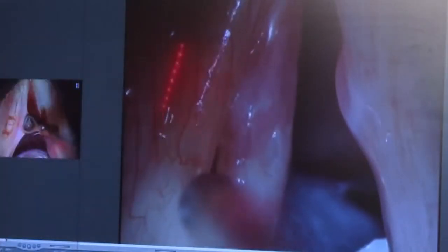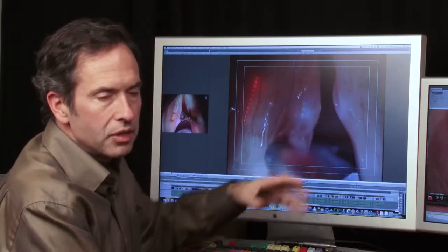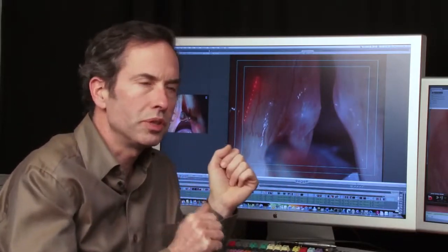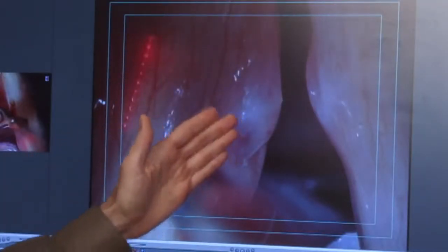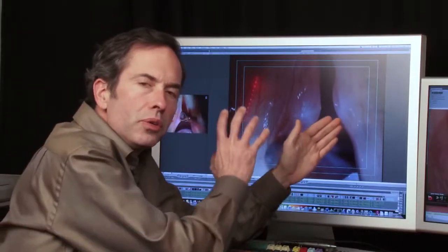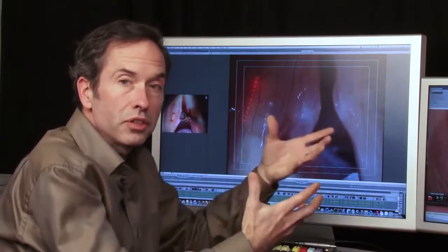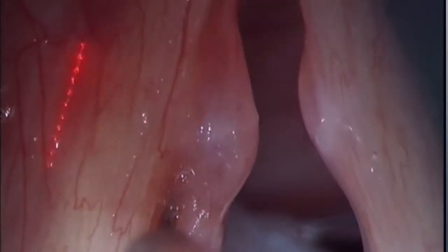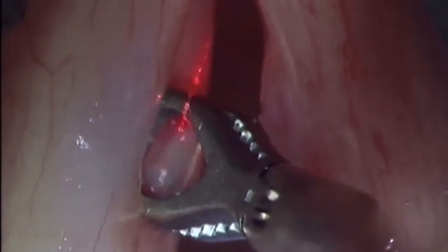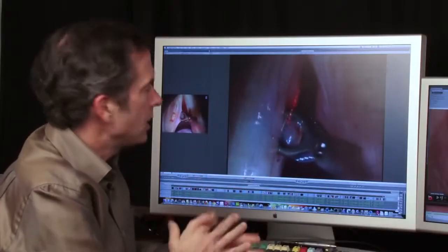Here's my laser off to the side. I'm going ahead and injecting some adrenaline in there to push the polyp out. The whole principle behind good vocal cord surgery is that here's the vocal cord, which is a muscle. There's a lubricating layer and then the skin. And we can remove the skin, and as long as we don't get into muscle, don't cut through the lubricating layer, the skin will regrow back across and we'll have flexible vocal cords. So to try to optimize her surgery, I am pushing this out with the injection. And then I will go ahead and grab the polyp and I will pull it as far across as I can away from the muscle.